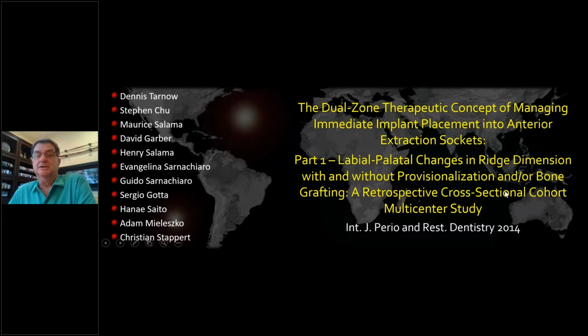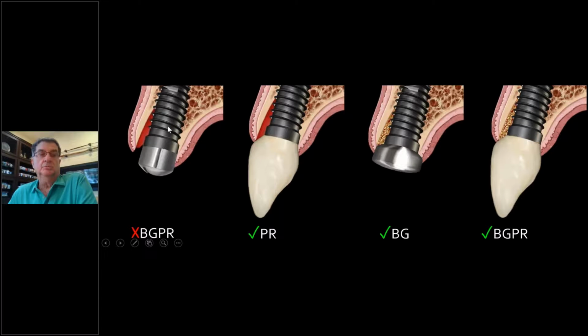So we published this in 2014, and we did 4 different procedures. We did what Uli Grunder did, just put the implant in to the palate, no bone graft, no provisional, just let a gap form with blood. Next one is just a provisional, no graft. Third group, put a bone graft in with just a healing abutment. And the fourth group, everything. Implant, bone graft, and a provisional. Everything, bone graft and provisional. And that's the group, that's what I just did, as I showed you in that clinical picture. And that's why we go to this, you'll see why.